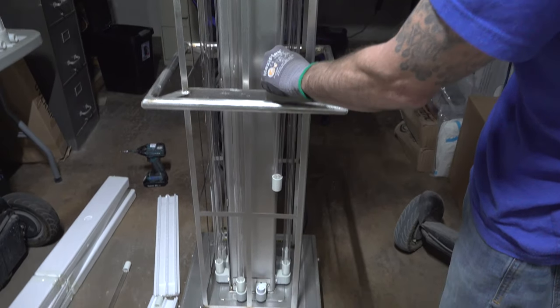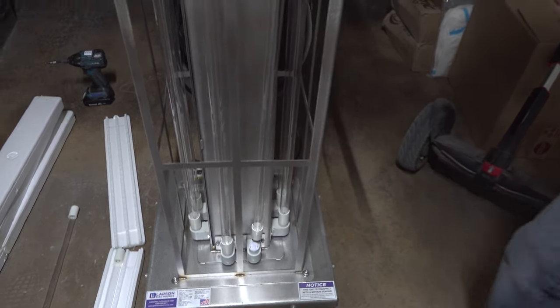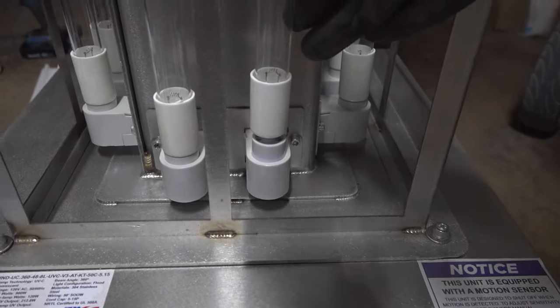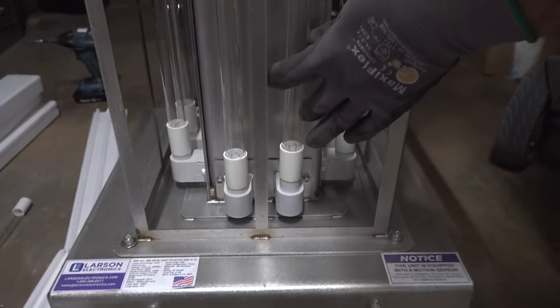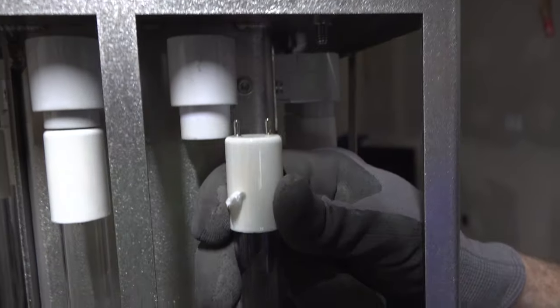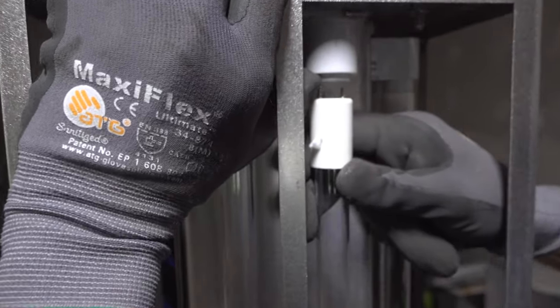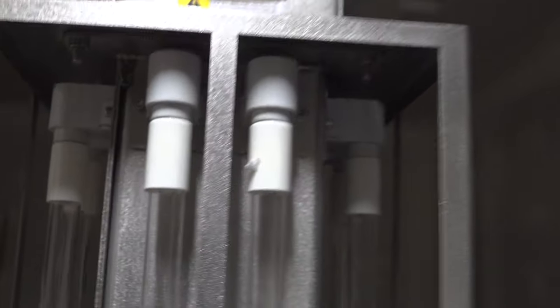Slide the bulb and align it where it sits in the tombstone, then simply depress the bulb. Press up on the tombstone and the bulb is exchanged.